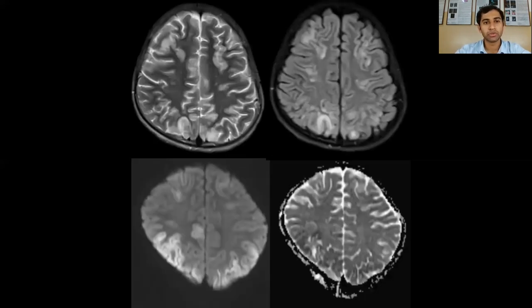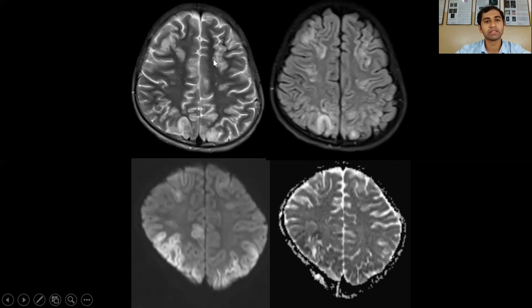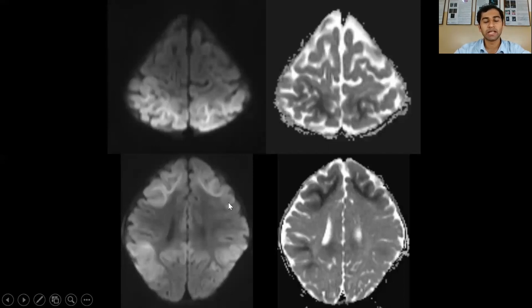This is the case of a 2-year-old male patient with complaints of generalized clonic seizures. On T2 and FLAIR images, you can see bilateral symmetrical hyperintensities in the frontal and parietal lobes. This area shows diffusion restriction on DWI and ADC maps.